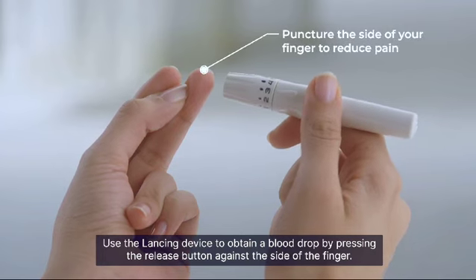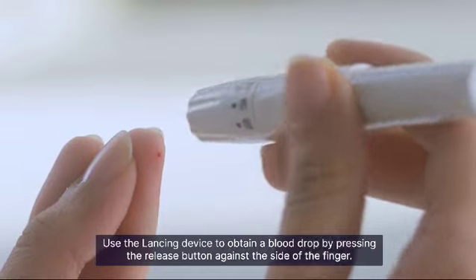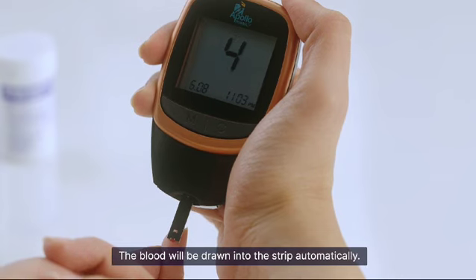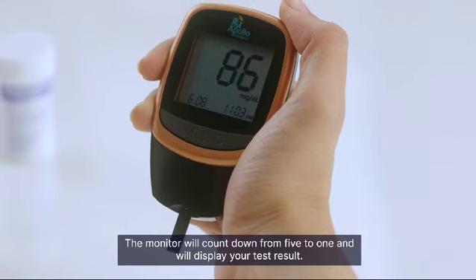Use the lancing device to obtain a blood drop by pressing the release button against the side of the finger. Touch the sample channel on the test strip to the blood drop — the blood will be drawn into the strip automatically. The monitor will count down from 5 to 1 and will display your test result.